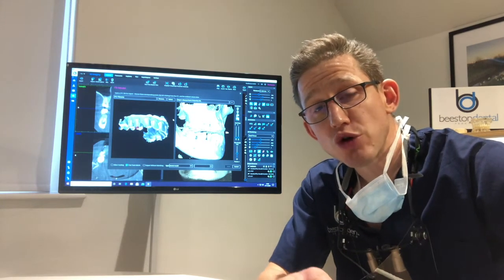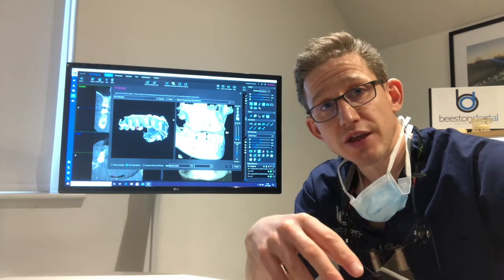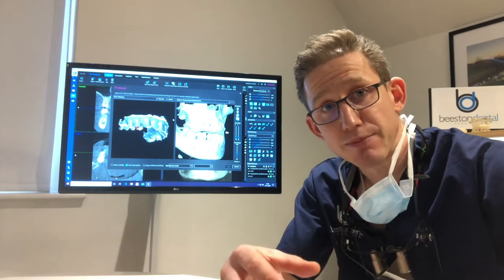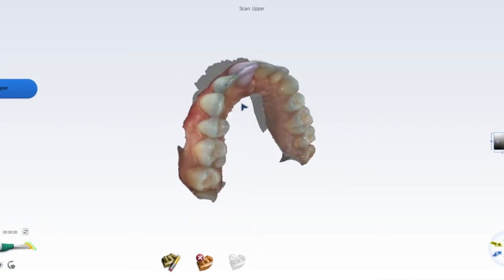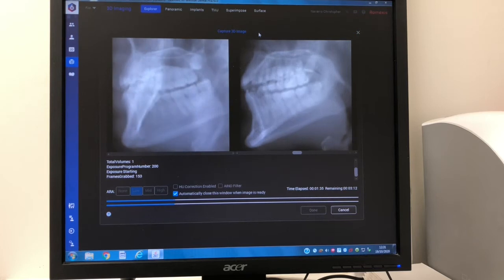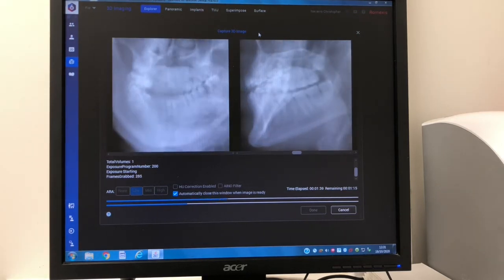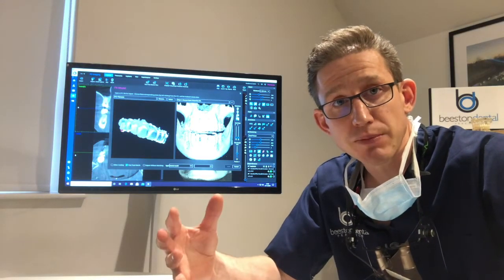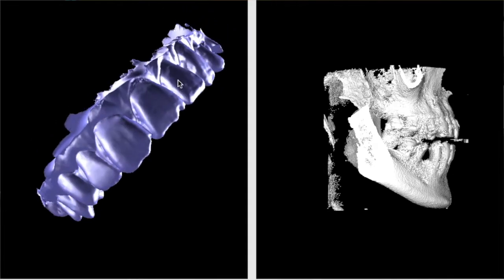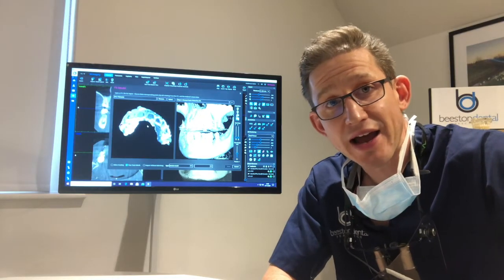In this episode we're going to superimpose the 3D surface scan model of your teeth — which is this model here — with the 3D CT scan of your jaw bone. To put simply, we're going to match up your teeth with your jaw bone and then use them to plan our implant placements.